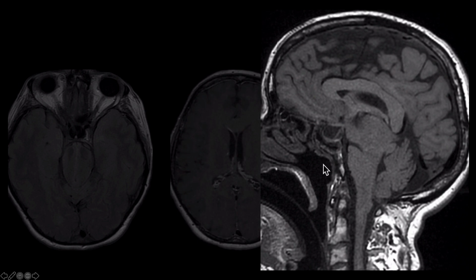Her MRI did not show a SLEC, so we were thinking about whether she has a leaking diverticulum, particularly because she did have some irregular diverticula or even a CSF venous fistula. We tried a couple of epidural blood patches which were non-targeted, but they had minimal response. And so we went on to do digital subtraction myelography under general anesthetic. What we saw was this irregular diverticulum at the C6 level with evidence of extra-diverticular contrast leakage. And on the CT myelogram, you can see these little squiggles that are opacifying with contrast around that diverticulum.